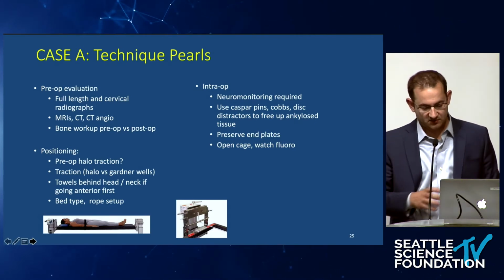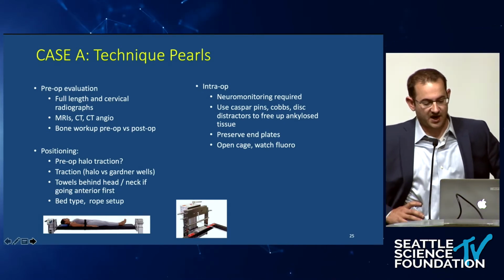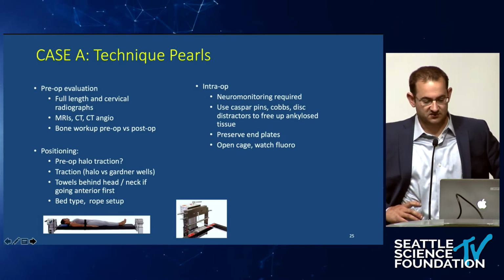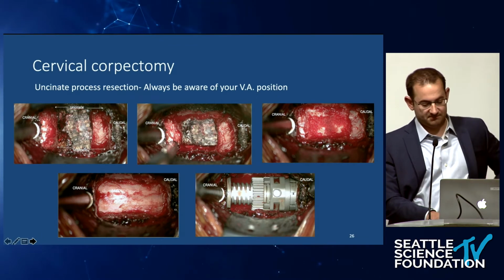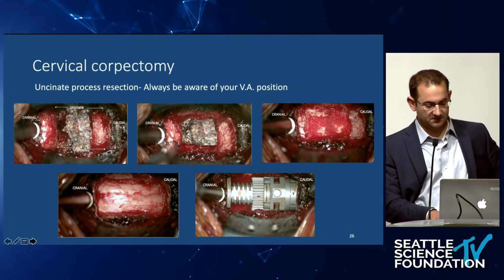I think it's like an arthroplasty mimic from Mobi-C that we built. Globus had a custom instrument. It gives me a ton of leverage to really crack open the anterior column and distract. But I'm meticulous about my neuromonitoring so I can do some of these things safely. Just some pictures from, not necessarily this case, but just a typical placement of this corpectomy cage.